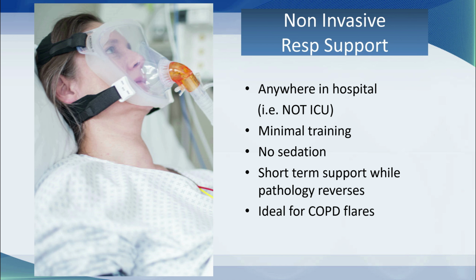There is minimal training needed, the patients don't need to be sedated, and in the short term, you can use this while pathology reverses, and there is compelling evidence for the use of non-invasive ventilation in patients who have flares of COPD.